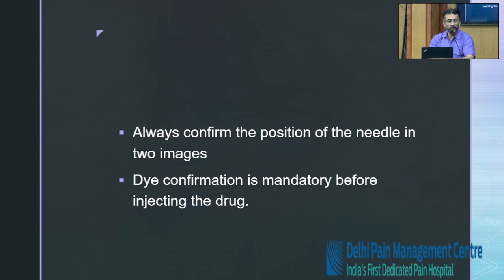Second thing is, since we are converting a three-dimension into a two-dimension, we need to confirm the needle position in two images. For example, if I am trying to touch the tip of my nose, people standing there will say yes, I am able to touch it, but the doctor sitting here will say no, there is a gap. Therefore, always try to confirm in a minimum of two or even more images, whether I am touching here, up, down, all the images will show that I am there. So do not be in a rush, confirm it in two or multiple images.